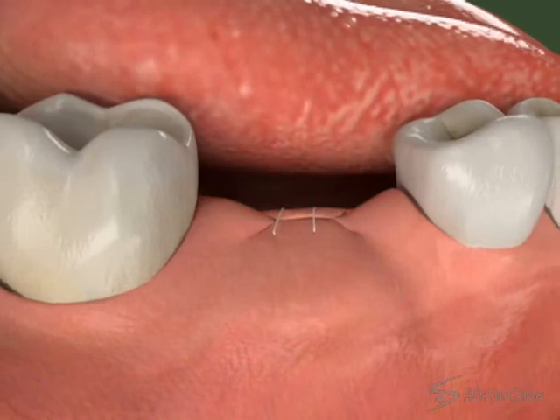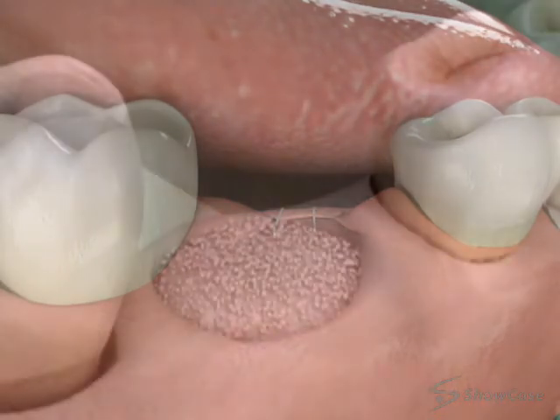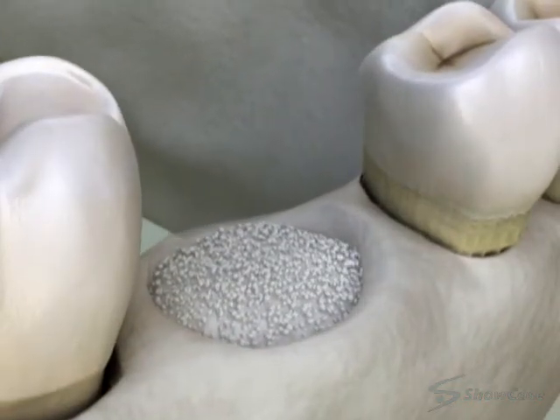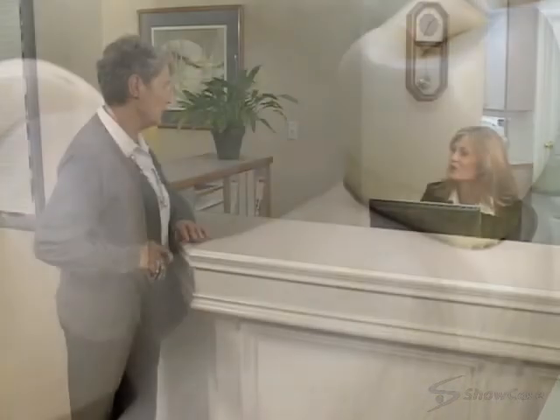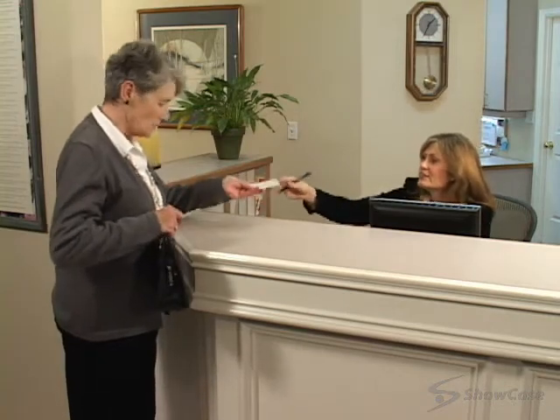The last step is to close the grafting site. Although situations vary, we may need to wait several months after the procedure for the bone to heal, before moving on to the next step of your dental treatment.